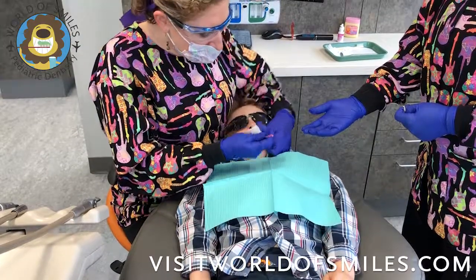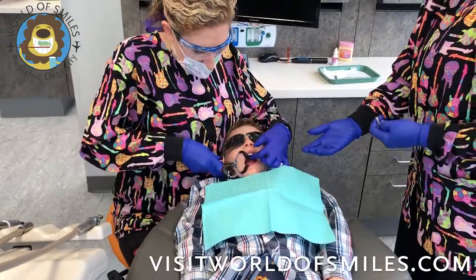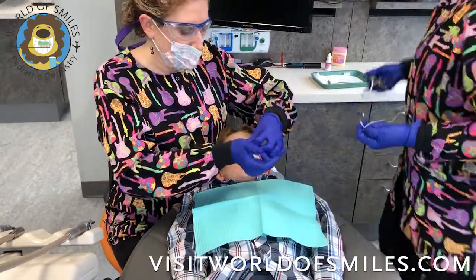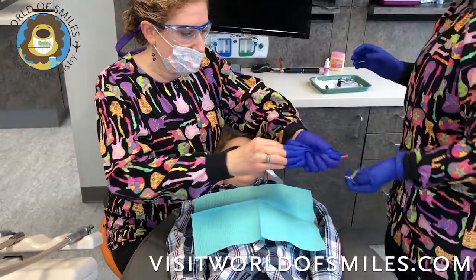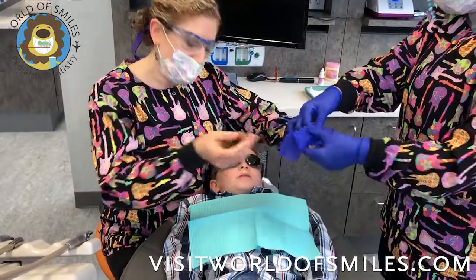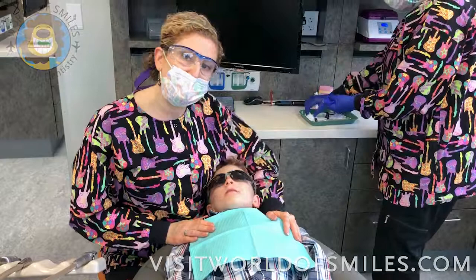And then when we're done, in order to minimize the staining, it's good to have everything in your glove and wrap it all up in your glove right away to minimize any of that silver diamine fluoride touching anything. And there is how we do an application of silver diamine fluoride.